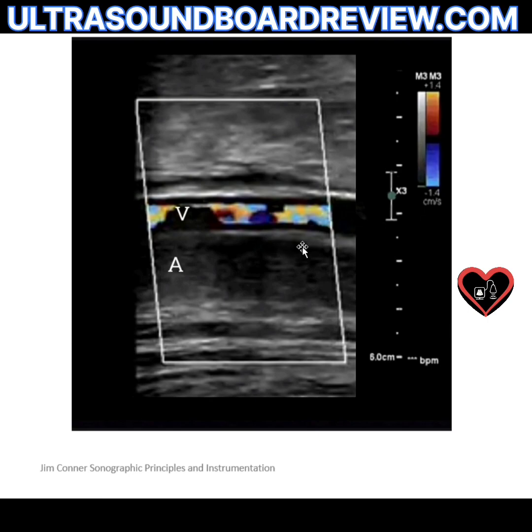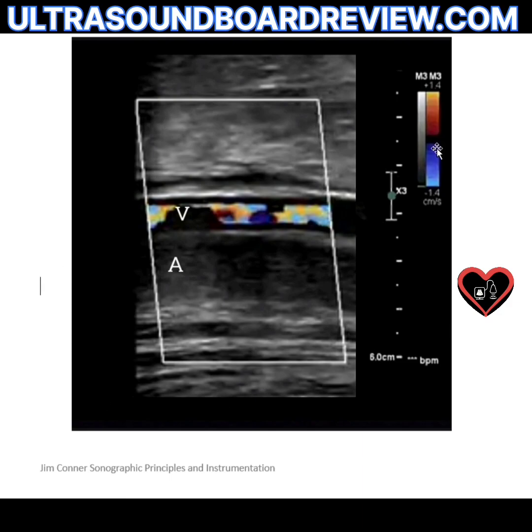Automatically you might think to fix the aliasing in the vein. But does that really matter? What's the main problem in this image? The artery.